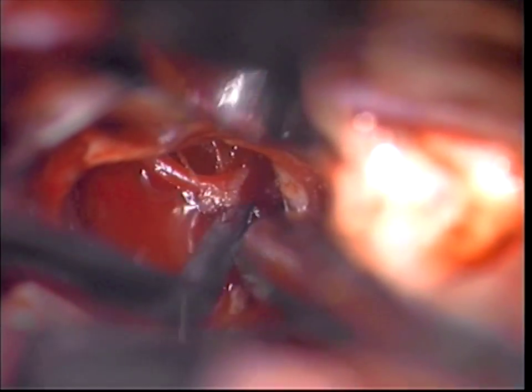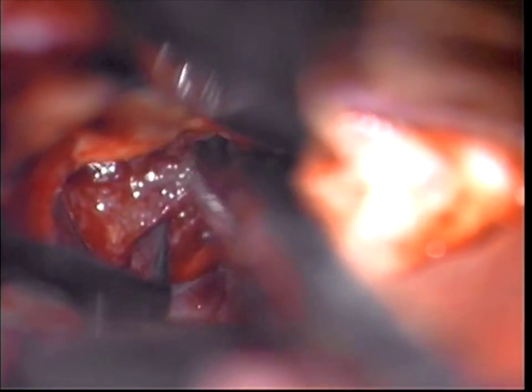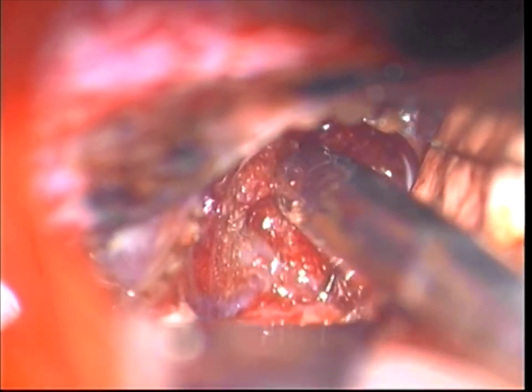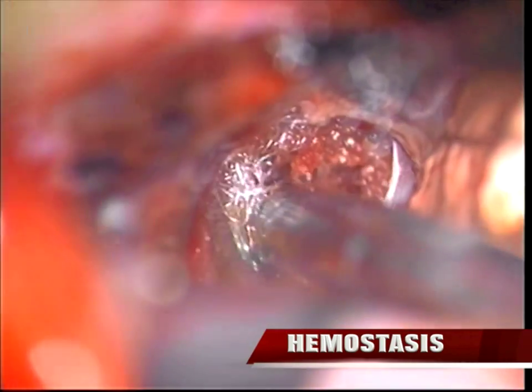The only portion I'm worried about now is on the left side. Here's a nice plane again — going to the superior part there. The goal, since this is a smaller tumor, is just to keep shrinking it and to work around it. Nice planes there. Most of the other part has been mobilized — there's a little bit of bleeding, trying to get some hemostasis there as well. These are non-stick bipolars — I kind of like these ones. Coming to the opposite side.